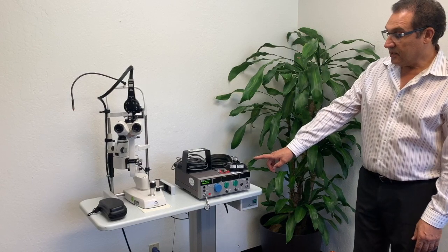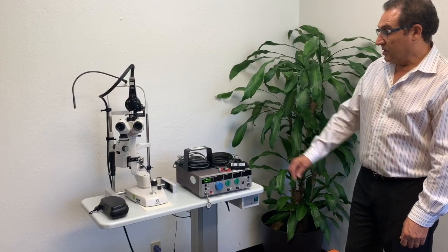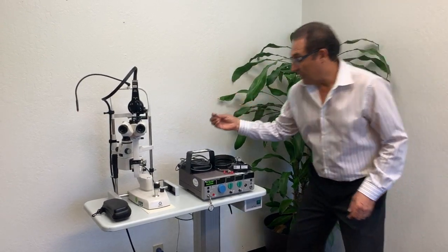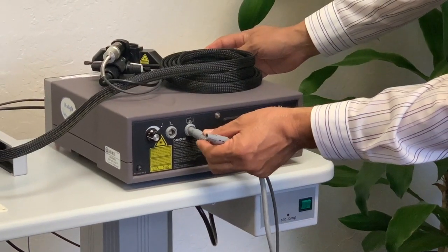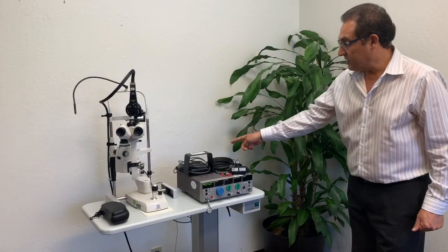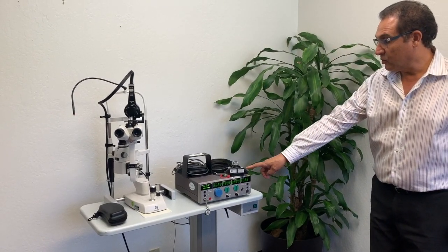The laser will ask where is the remote interlock. The remote interlock is this plug that goes at the back of the laser — there is a place for the interlock; just plug it in and you should hear a click. Once it's in there, the laser will recognize that and then go to a self-test.